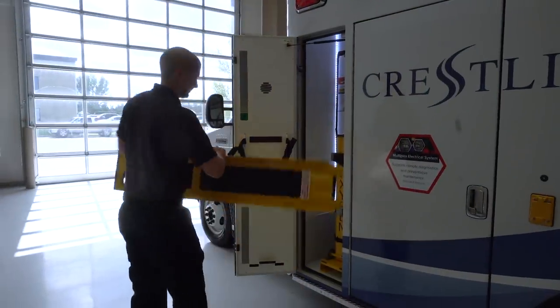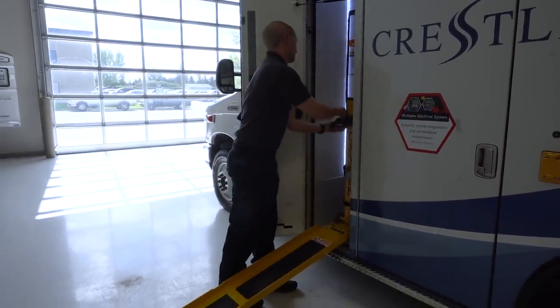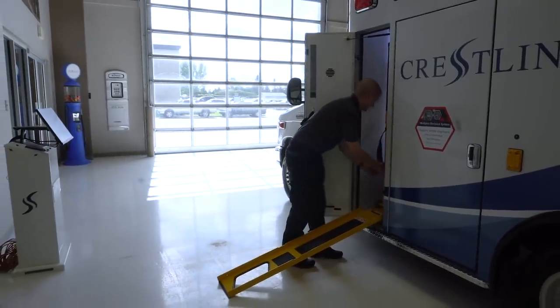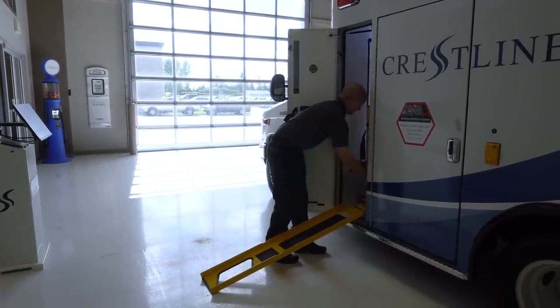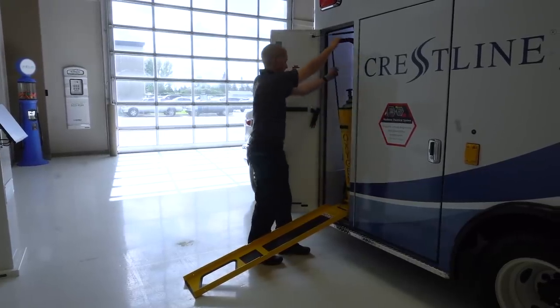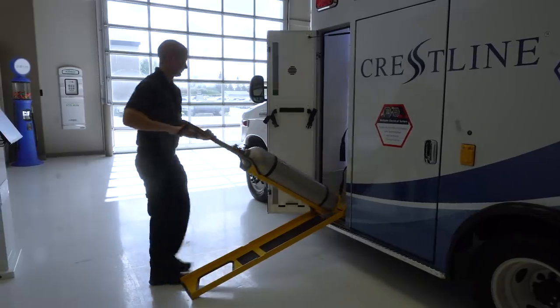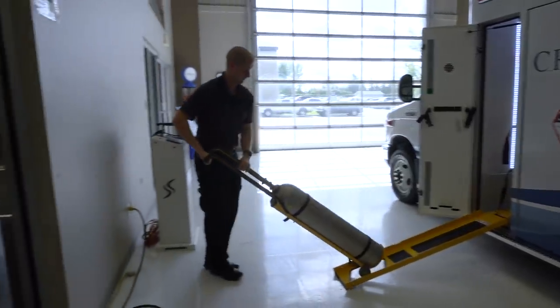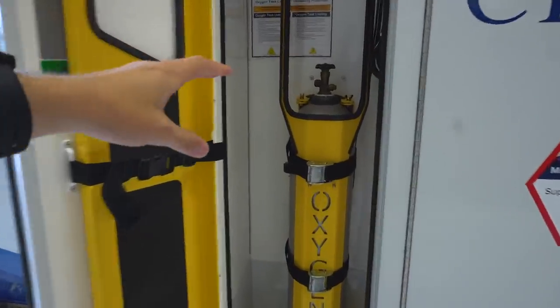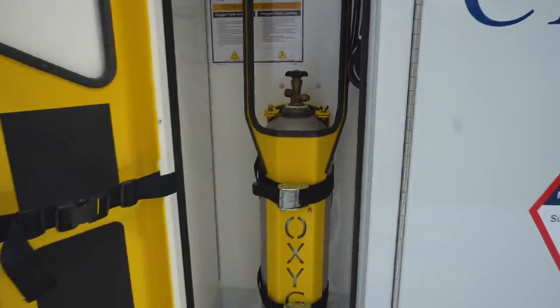This cabinet is the O2 cabinet and it has their O2 to go system, which is a simple ramp system to get the oxygen tank in and out of the ambulance without having to lift it. What's really cool is it doesn't have any hydraulics or electronics on it, so there's nothing to break. It's literally a ramp — you pull it out on the dolly, replace the tank, push it back up, and you don't even have to take it off the dolly to secure it in here.